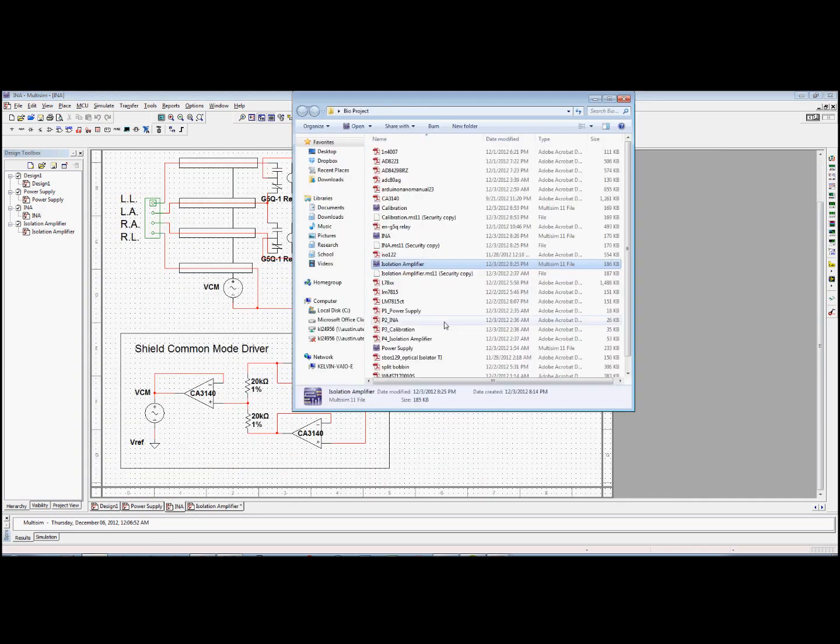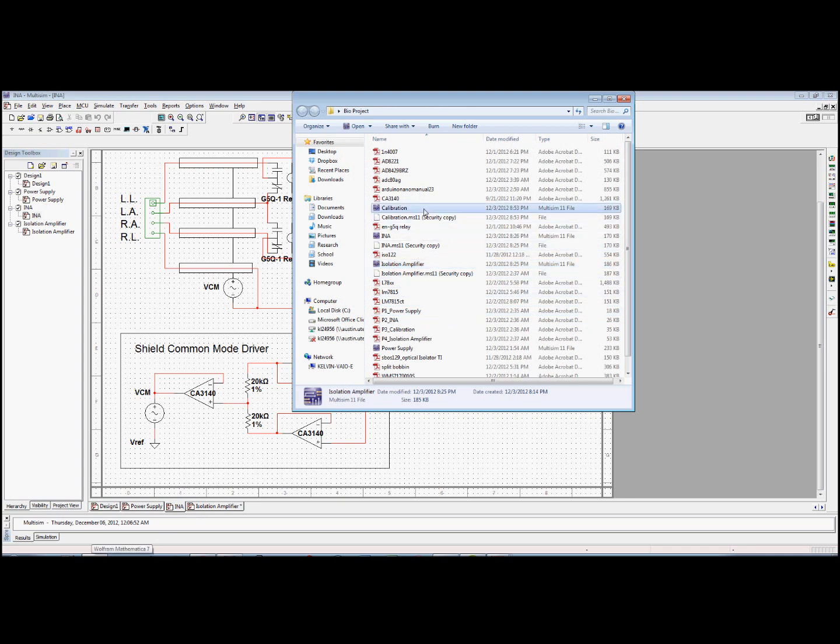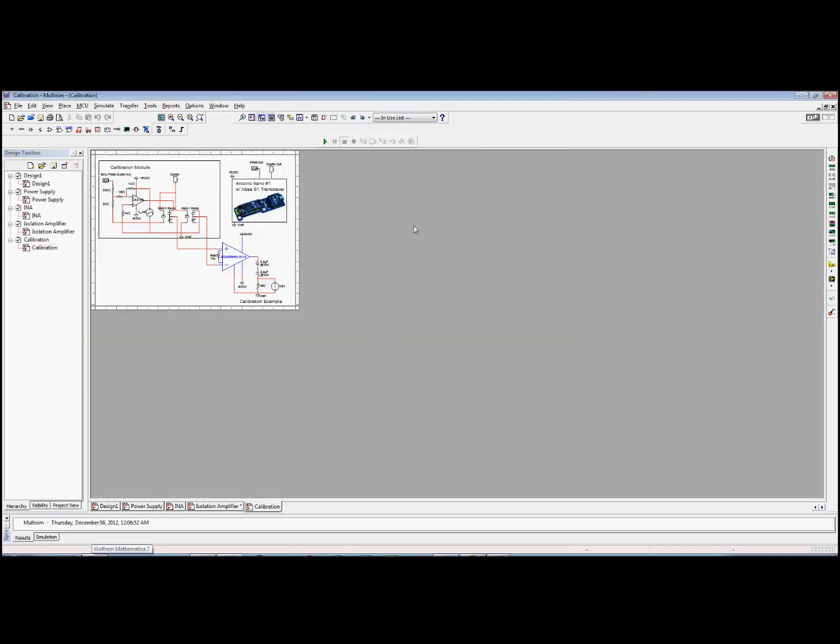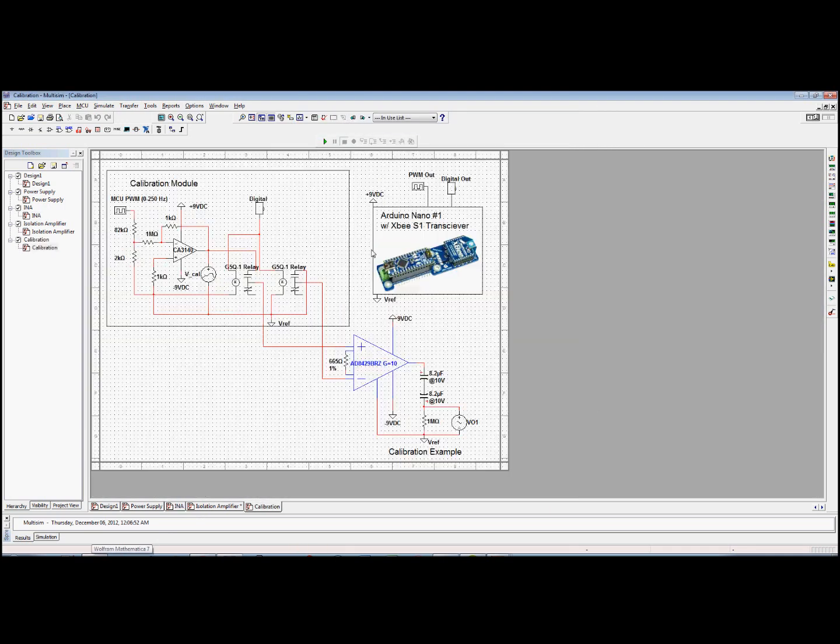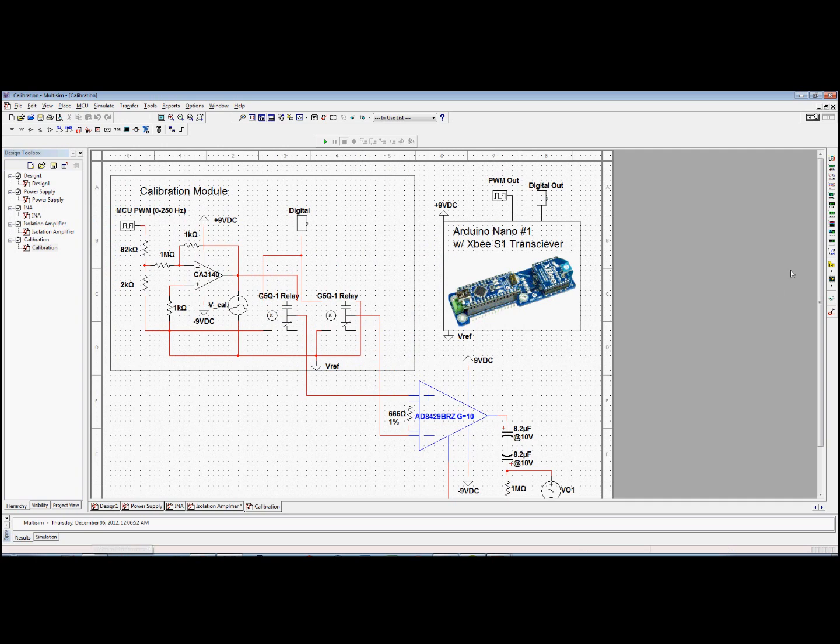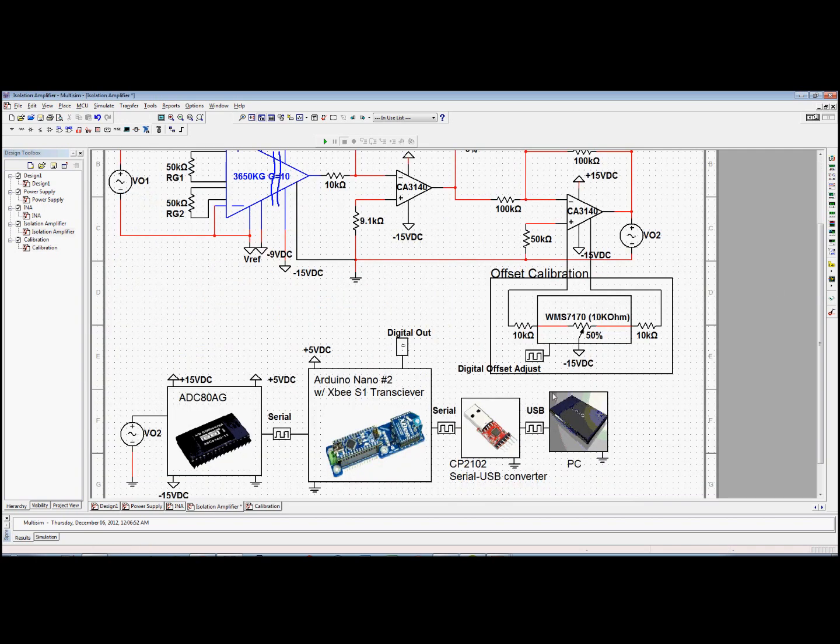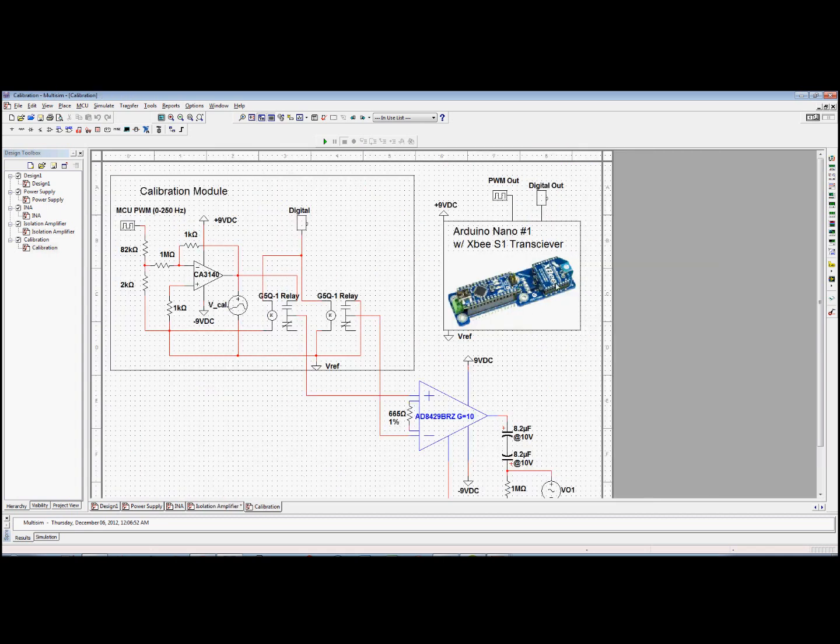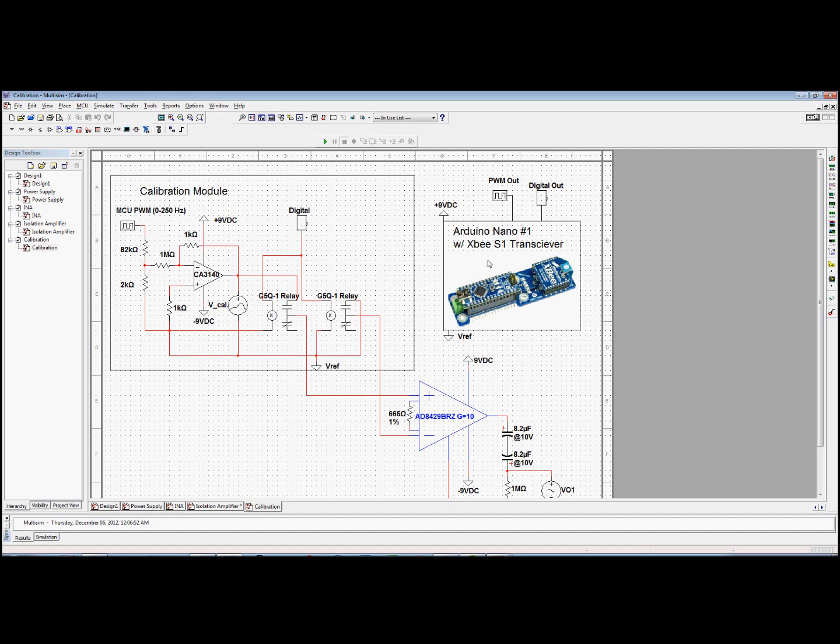When my Arduino here detects the signal level and whatnot, and I'm trying to adjust it. Then they'll send out a signal here. Hey, say hey to this Arduino, the first Arduino actually. This Arduino will send out a calibration signal. It will generate a signal here.